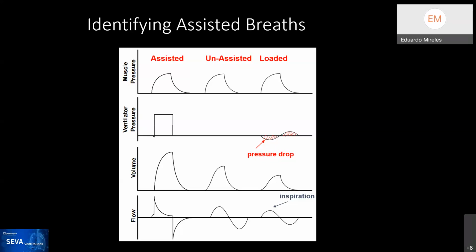Great, Rob. Does assistance help define or classify modes of ventilation? No. Whether or not assistance is being provided is independent of the mode of classification.